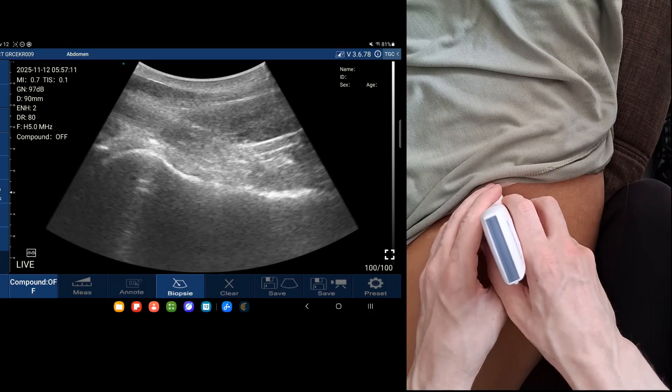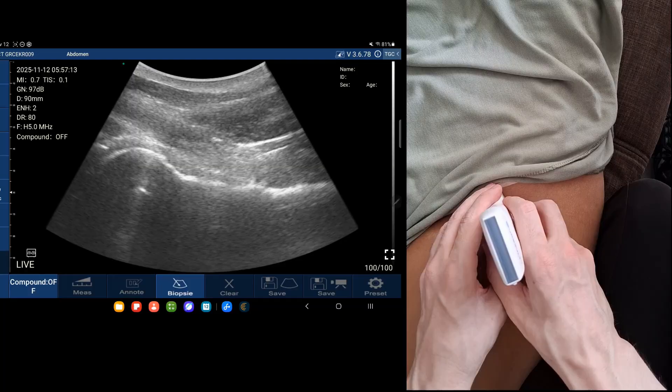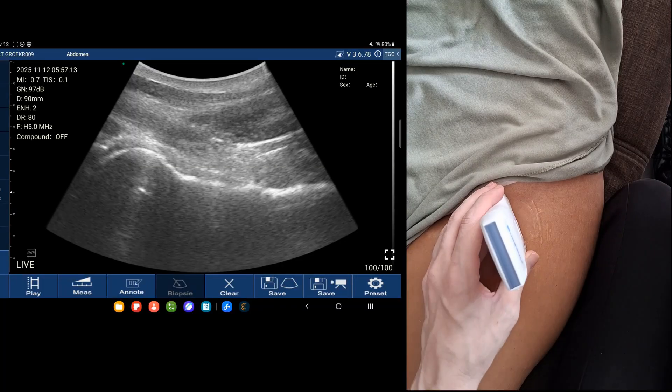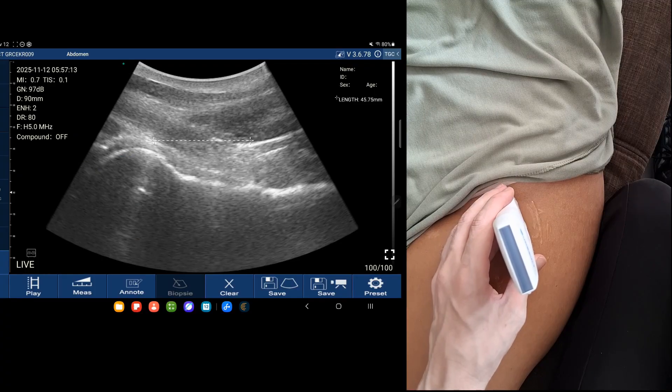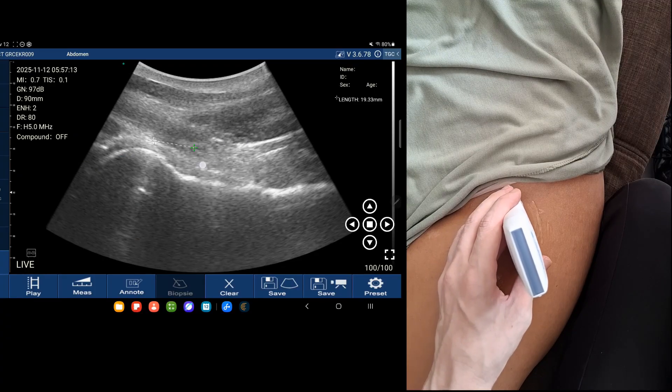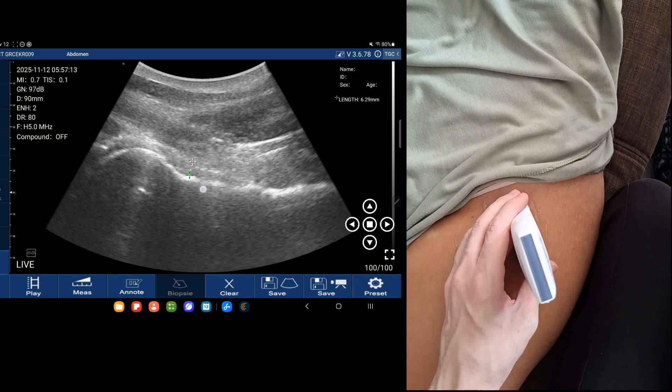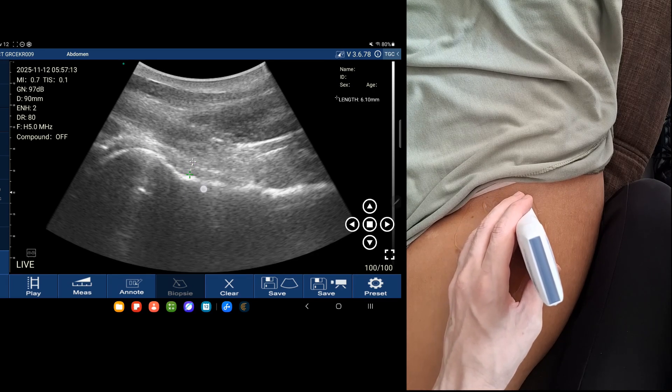There we have it — there's our picture and I can freeze it. On the picture we can take a measurement: from the top of the capsule to the bottom of the capsule, and you can see that it's under seven millimeters. So no joint effusion.